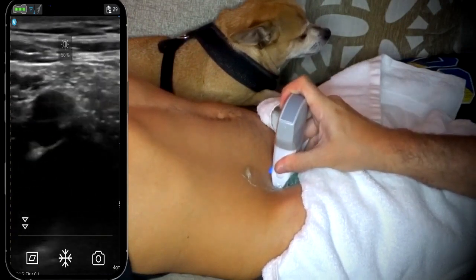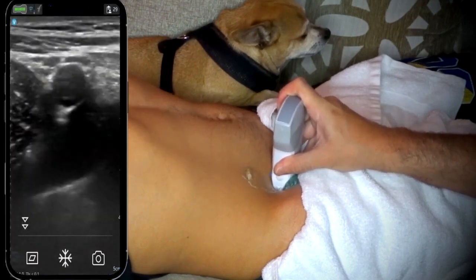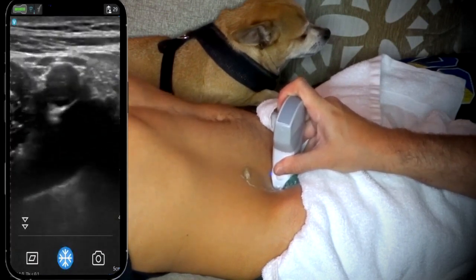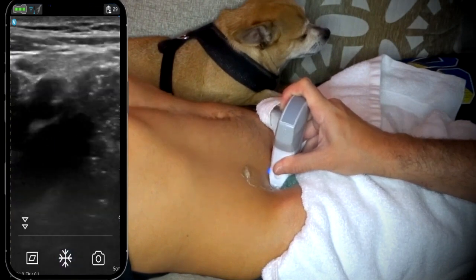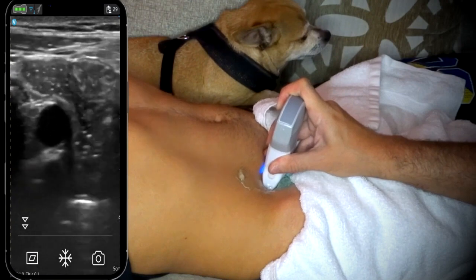Find the iliacs. That's right there. So iliacs and transverse. Take that picture. Oftentimes you'll see the appendix draped over the iliac artery right there. This is not one of those times.